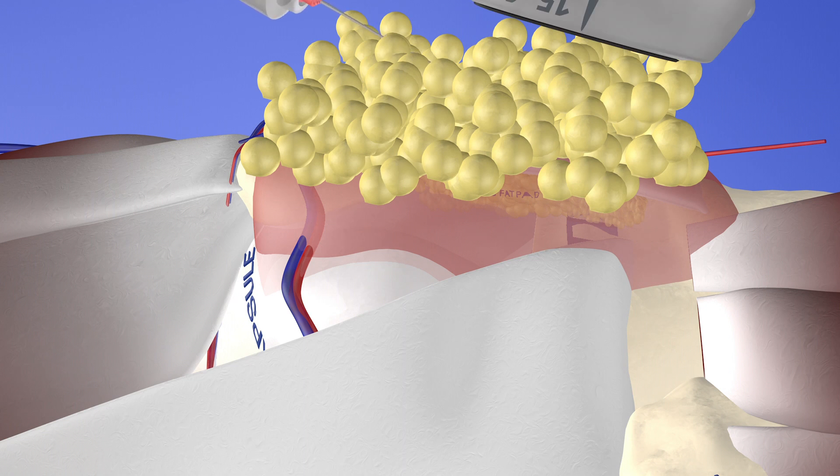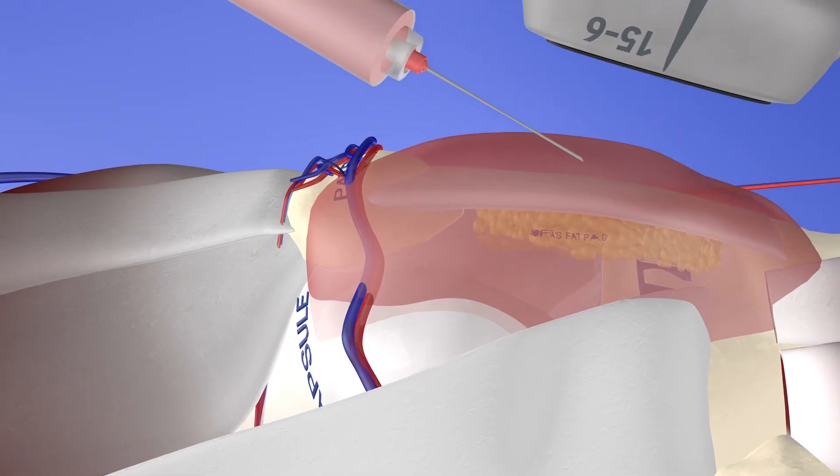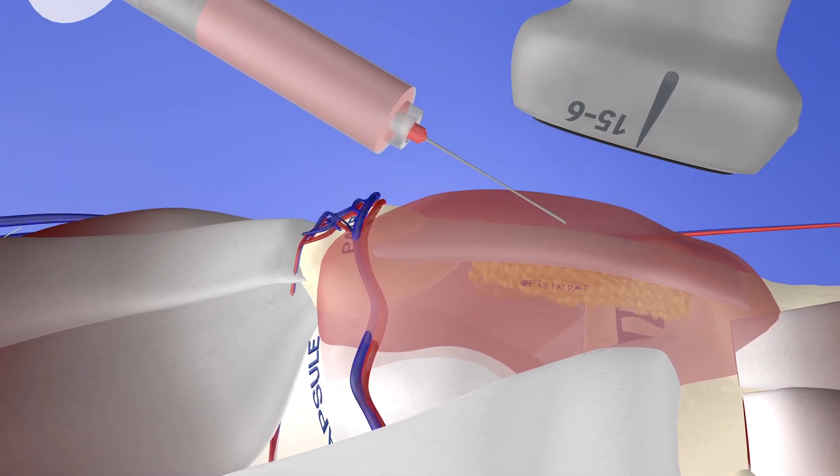Here's our needle, which you can see at the top of the screen. It is going through the subcutaneous fat into this Morel-Lavallée lesion. You can see the probe on the very top of the screen as well. With the fat removed, you can get a sense of exactly where this needle is and how close it is to the patella tendon, which is why ultrasound is helpful to avoid injuring the patella tendon with the needle.